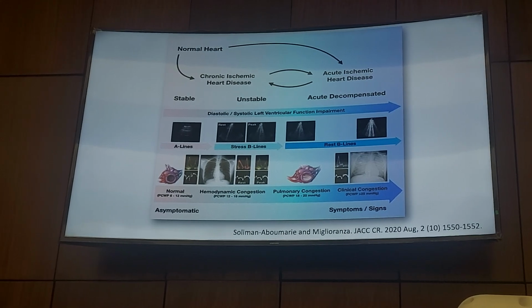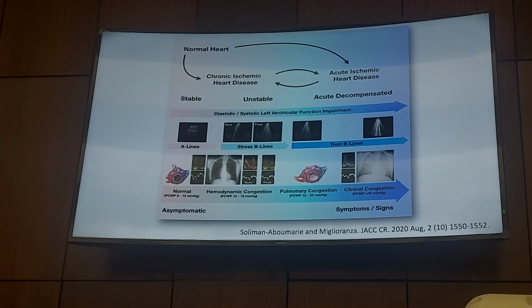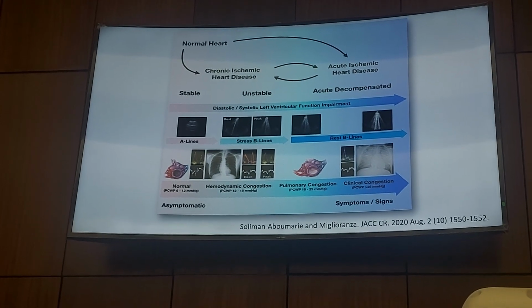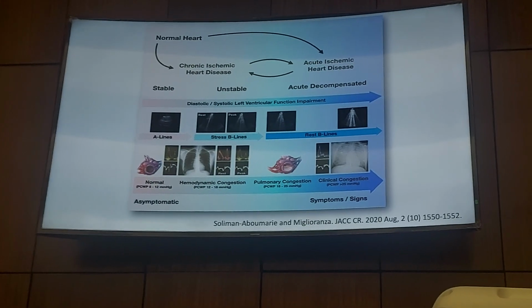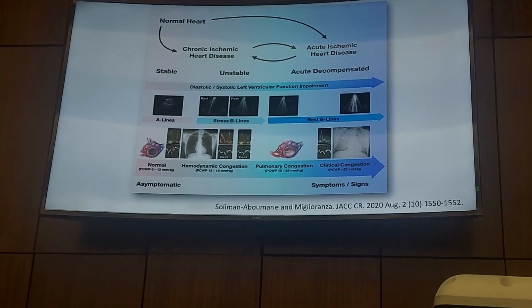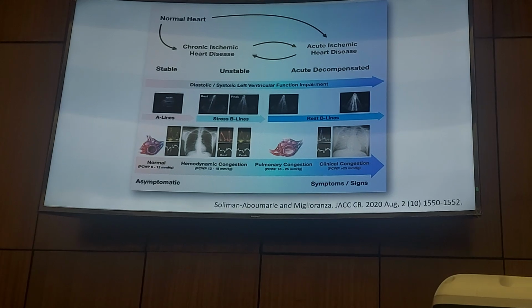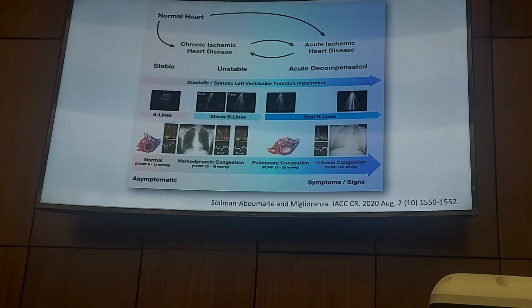The emergency physician in this hospital luckily knew how to do lung ultrasound. He was doing echo, and then looked at the lung, he saw B lines everywhere. And that was shocking. Why would there be B lines everywhere in a young patient with normal ECG? So he looked at the echo, there were wall motion abnormalities in the anterior LAD territory. The patient was taken to the cath lab, there was a critical left main occlusion. And the LVEDP recorded in the cath lab was 35 to 36.